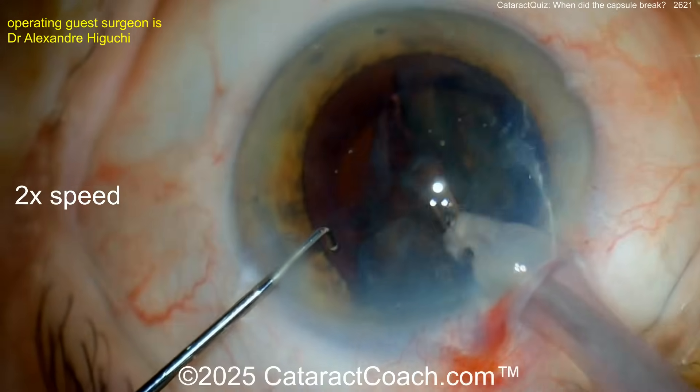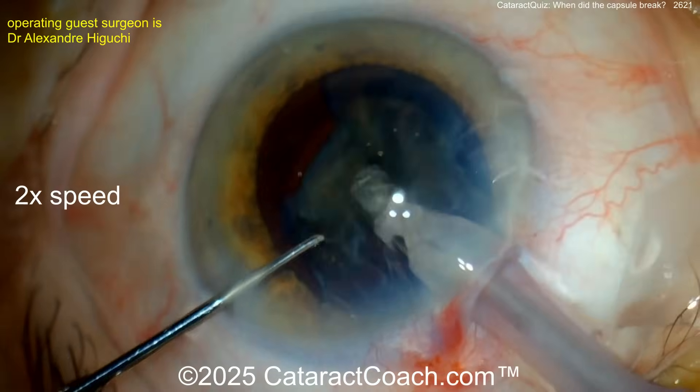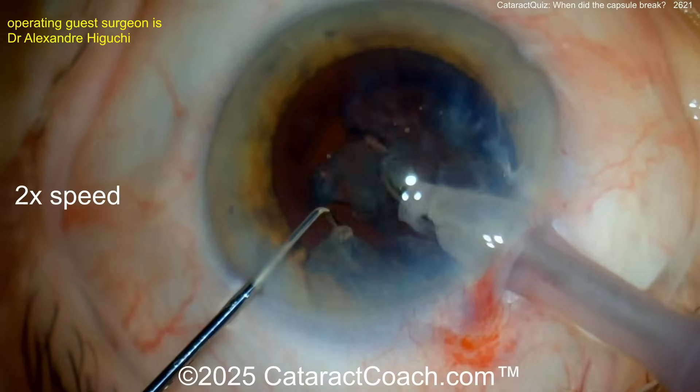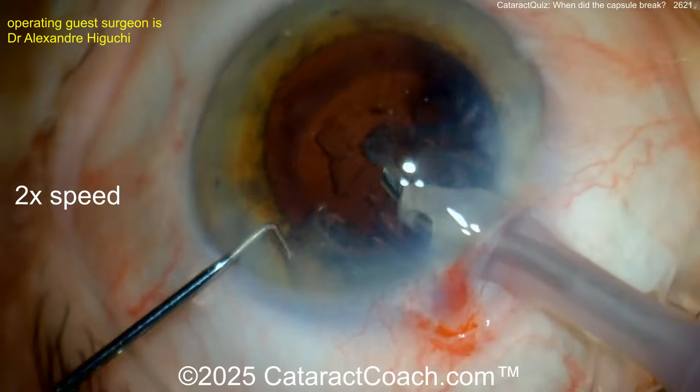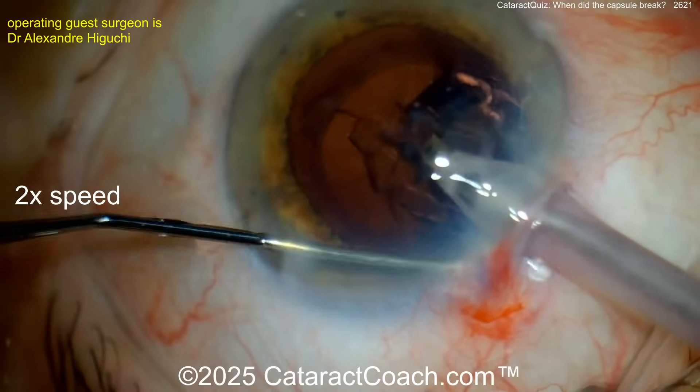That's how we're getting through it quickly. Experienced surgeons are more likely to break the bag during cortex removal. Let's watch carefully — everything looks reasonable so far. The nucleus is coming out pretty easily. Again, a routine case, nothing out of the ordinary.